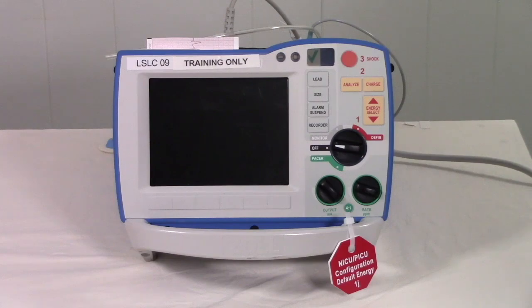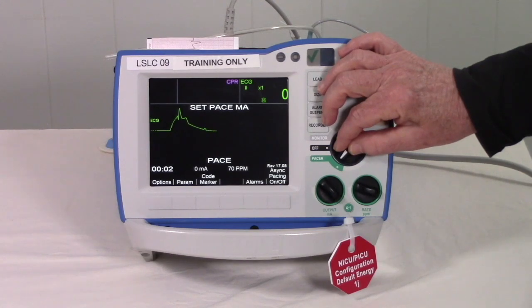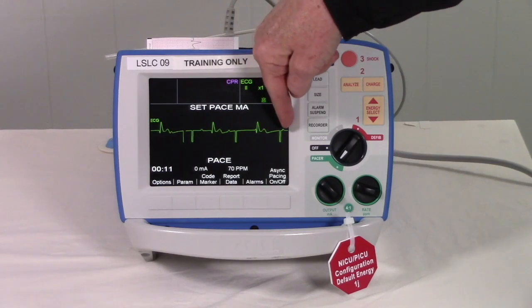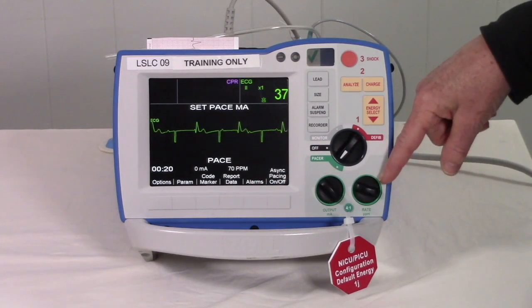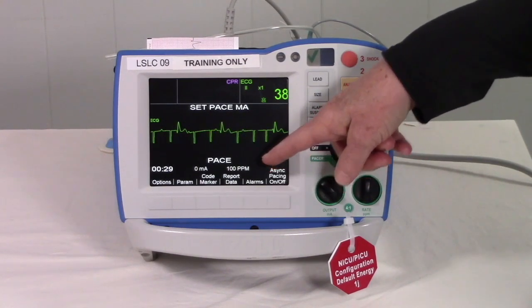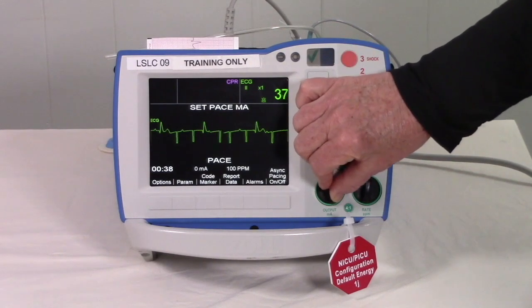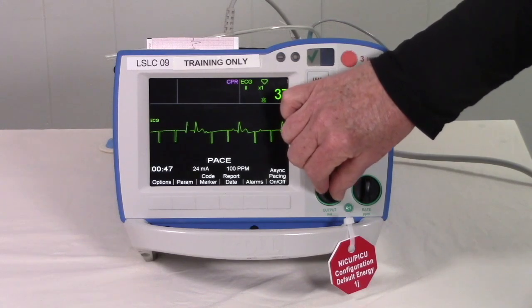Now we'll review pacing in the neonatal ICU with the Zoll R-Series. Your patient needs pads as well as a 3-lead ECG cable in order to pace. Turn the Zoll to pacer. You will notice this child in third-degree heart block. As you turn the pacer on, you see pacing spikes, but there's no response, so you know pacing hasn't captured yet. The default is 70 pace beats per minute — go ahead and turn that up to 100. Now at 100 pace beats per minute, increase output until you have good capture. Good capture is indicated by a pacing spike and a ventricular response behind each one.